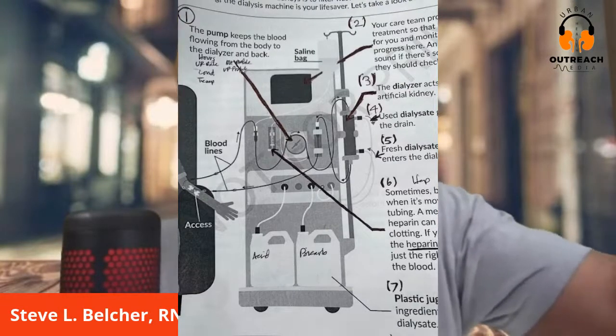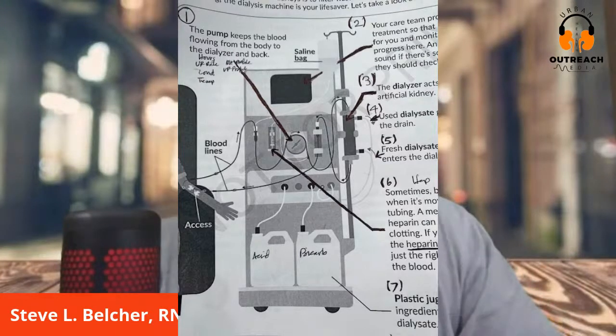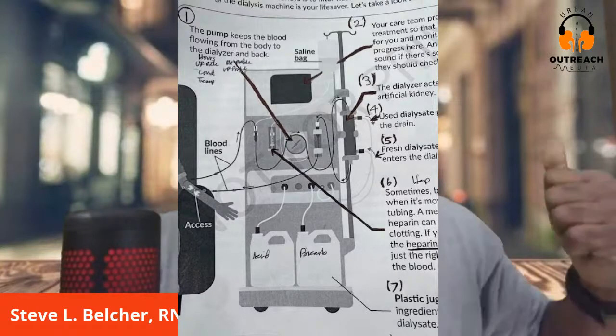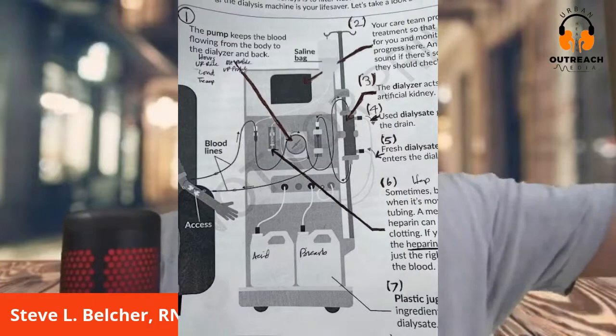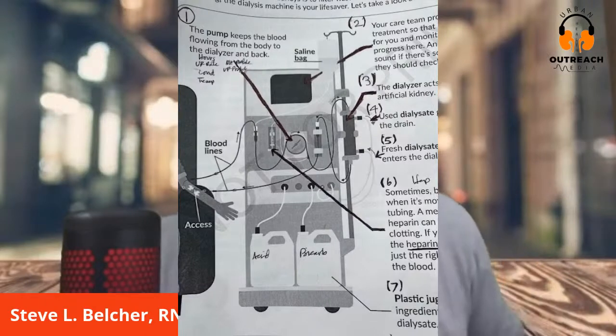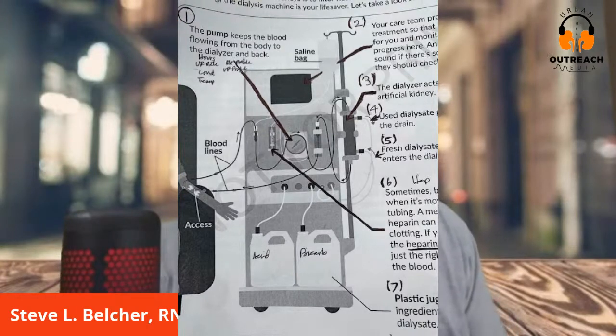Each patient has a different blood flow rate. If I was on dialysis, my blood flow, say, Casey may be 500 and Louise may be 350. So if you see your number on your blood pump different than your comrade sitting next to you, just know the doctor sets each person differently, or they may have the same blood flow rate. Again, if that pump stops, you're at high risk for clotting. That's the blood pump. All right, let's move over to the right, number two.